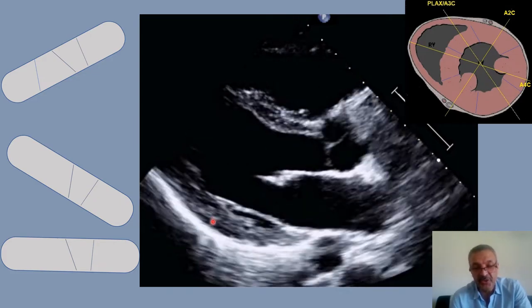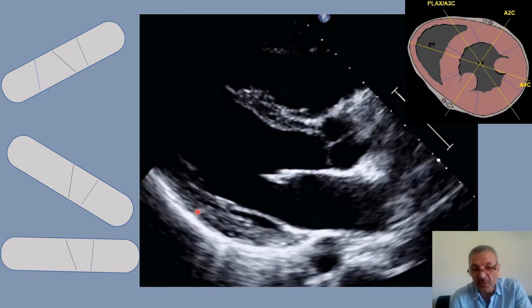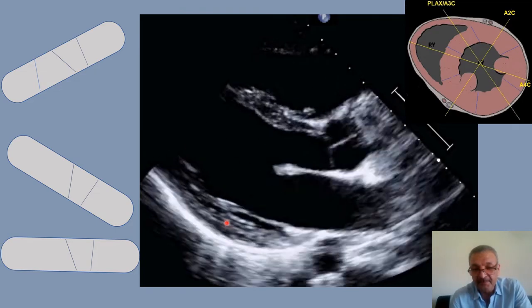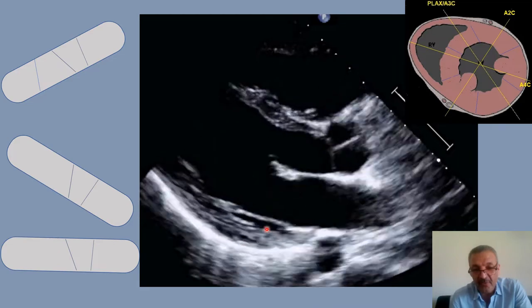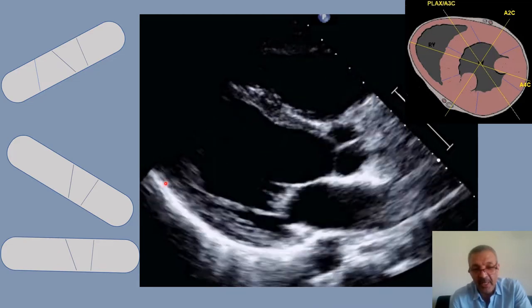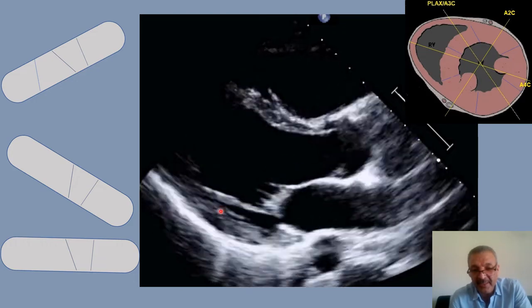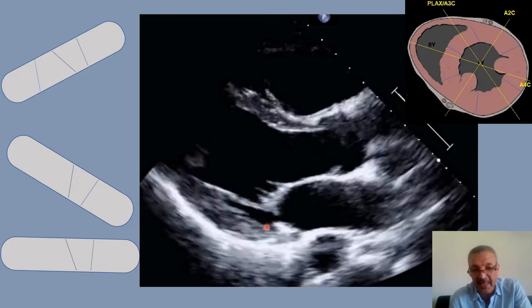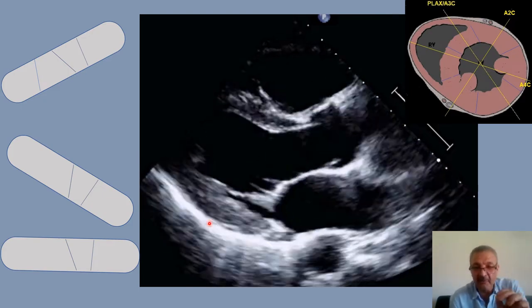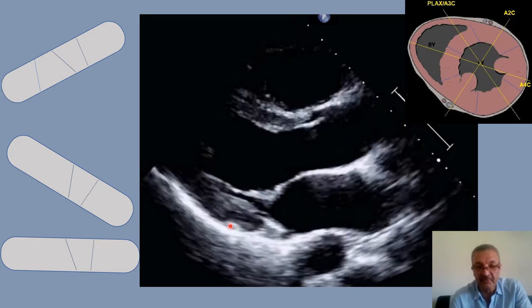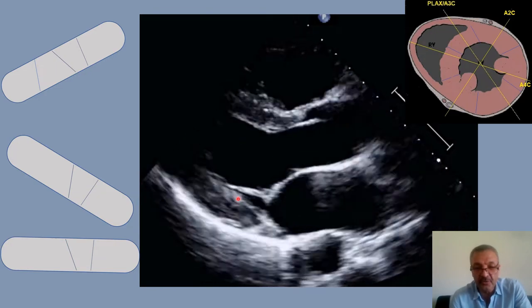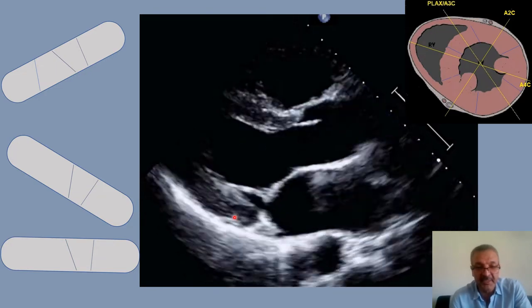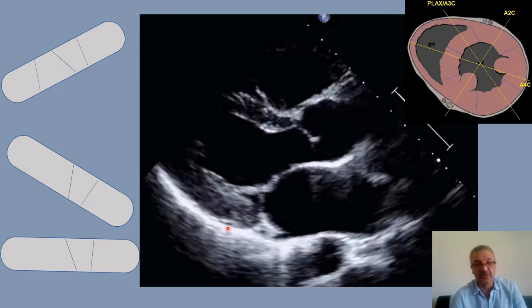At the posterior wall too, if you notice chordae tendineae coming into view, go along the entire posterior wall and notice that the real border is deeper. If you look carefully, you can see a slight hyperechoic line between the chordae tendineae and the real myocardium. Place your marker there and measure for the posterior wall.